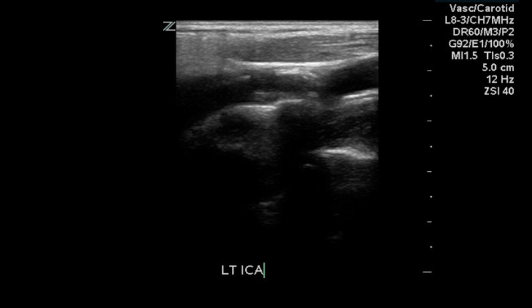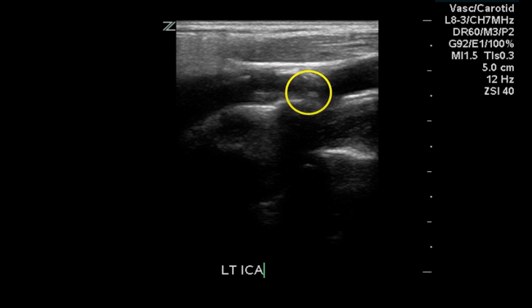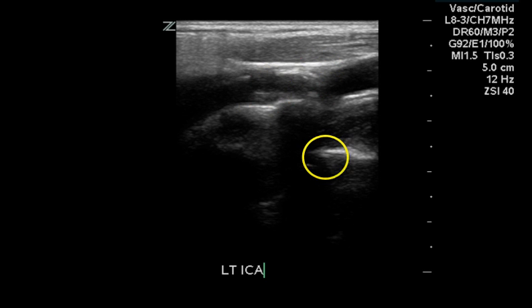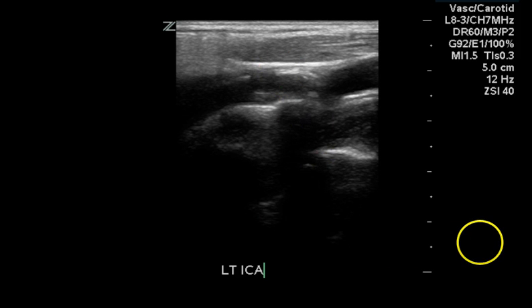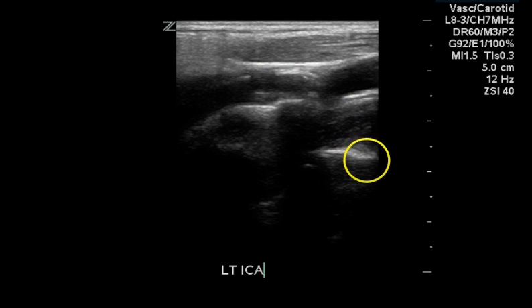This is an image of the left internal carotid artery. We see some echogenic plaque as well as some hypoechoic plaque. There is a small amount of acoustic shadowing, indicating some calcification most likely in this portion of the plaque.